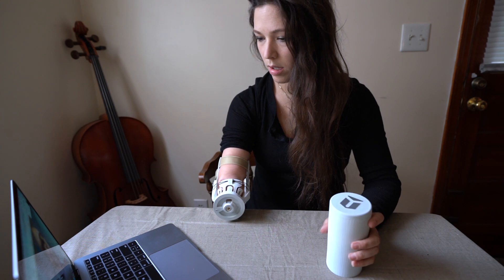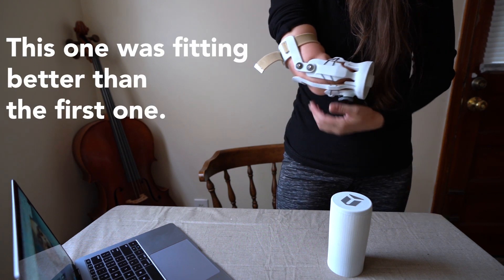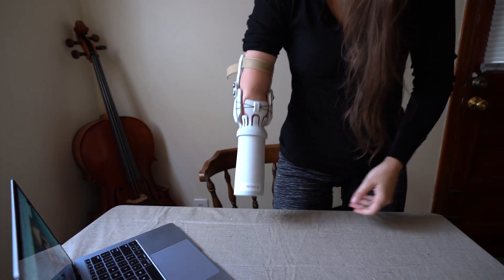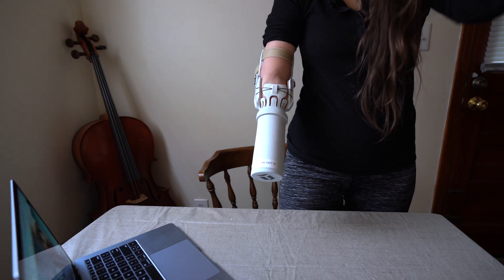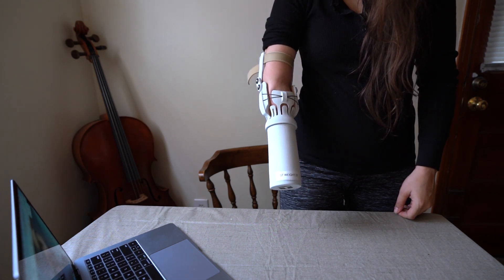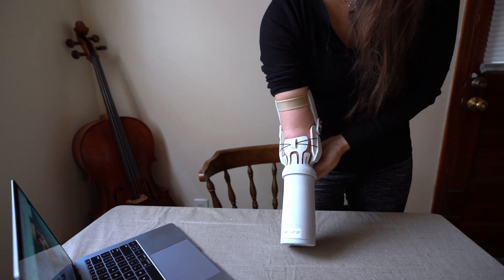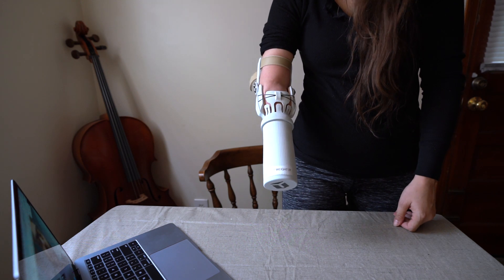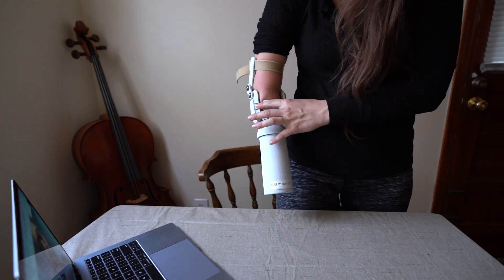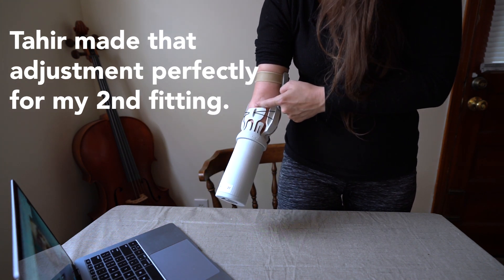With the white socket, Abby's limb appears dead center — much better than the red one. She attaches the weight and bends at the elbow. The clinician notices a gap forming and asks if it increases with movement. Abby confirms it does, and she ratchets it a few clicks which feels better. She notes she has to pull her arm inward to get leverage, and feels that even a quarter inch more support just below her elbow would help with control.